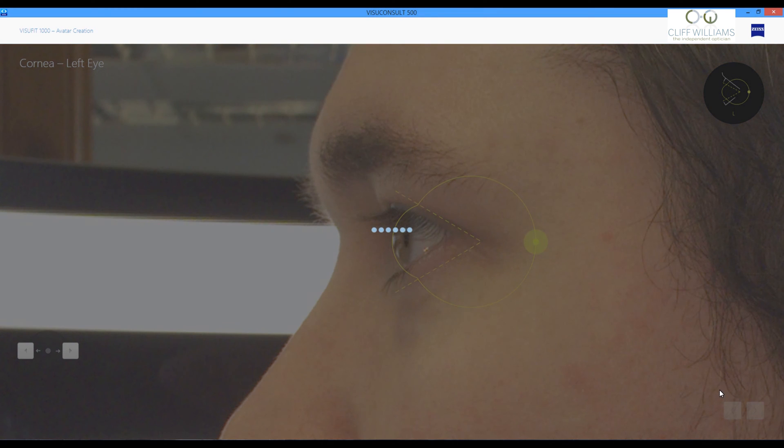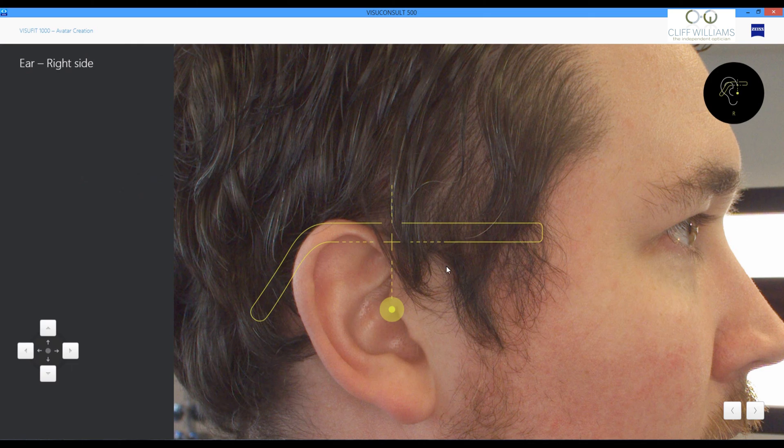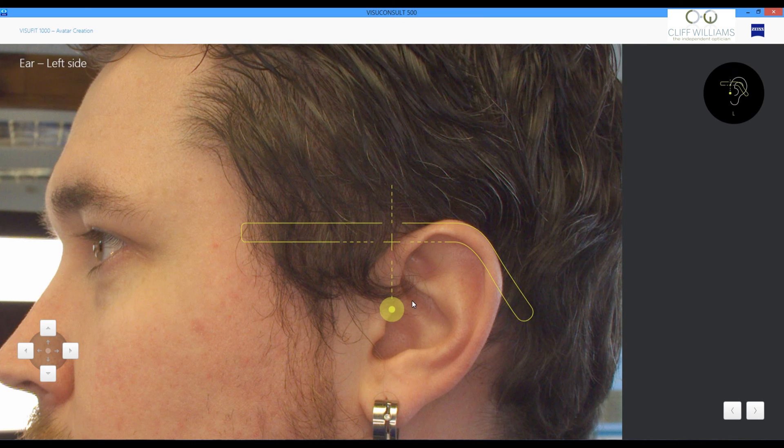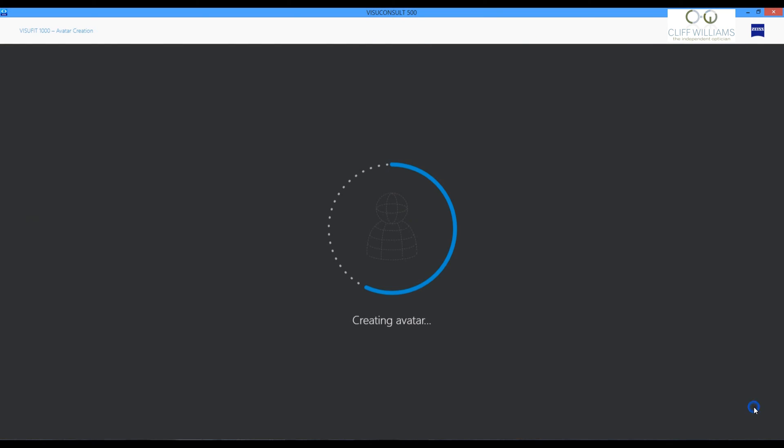We will then mark off the ear point position from the side. Do that for both sides. This is then saved as an avatar.